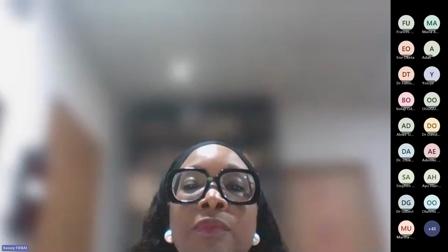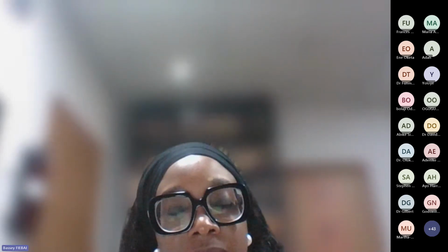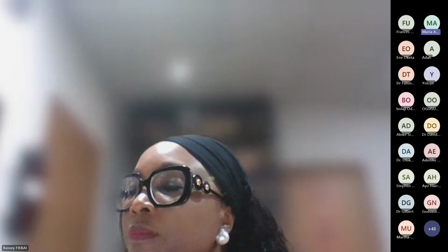But with the longitudinal, you're putting it perpendicular to the limbus, to bypass the lens. You know that when you do an axial scan, the lens is going to absorb some of the echoes, so you're not going to get as strong an echo and resolution as you will get if you bypass the lens. You understand? I do, yeah. Oh, okay. Any other question? Thank you.